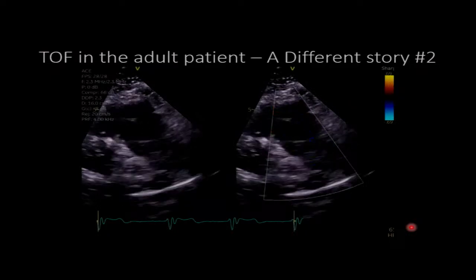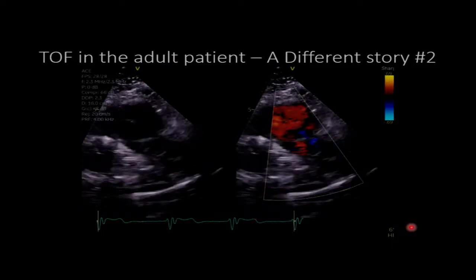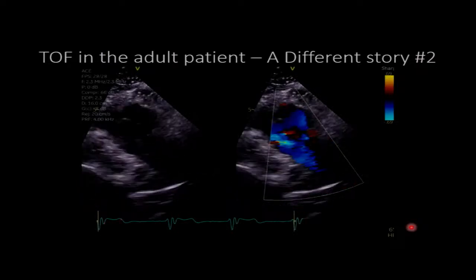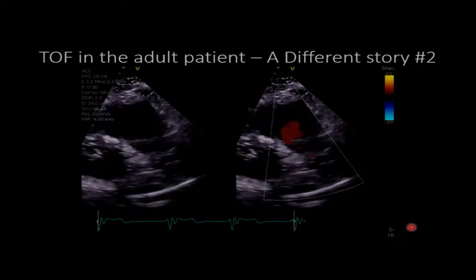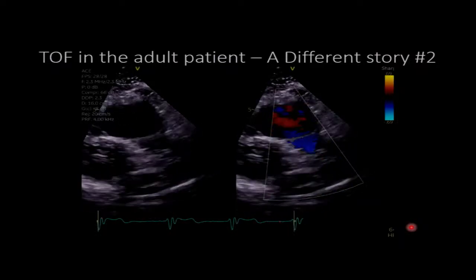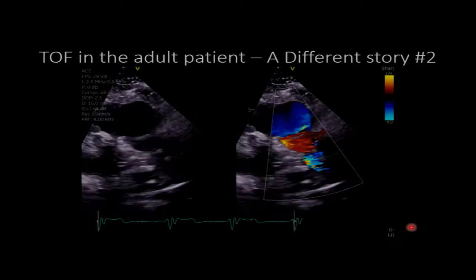So when you have patients with free pulmonary regurgitation or severe wide open pulmonary regurgitation, sometimes when you repeat MRIs, the regurgitant fraction may be a little lower one day compared to 3 years ago. If the regurgitant fraction is lower in follow-up MRIs with wide open PR, did it get better? Is it less severe now? What happens is your RV may be thicker, so the PR time may be less, diminished.